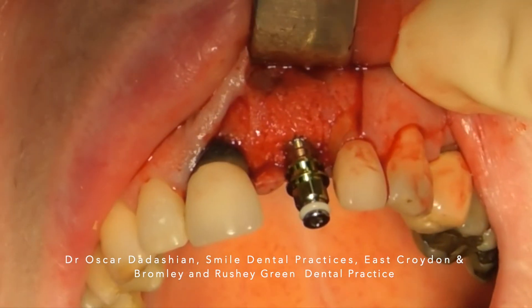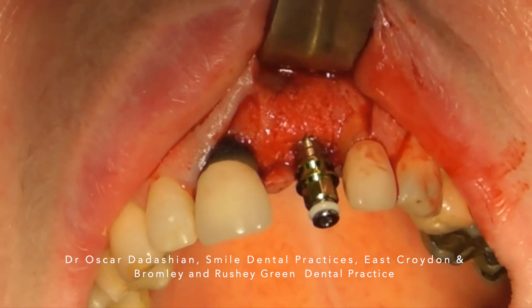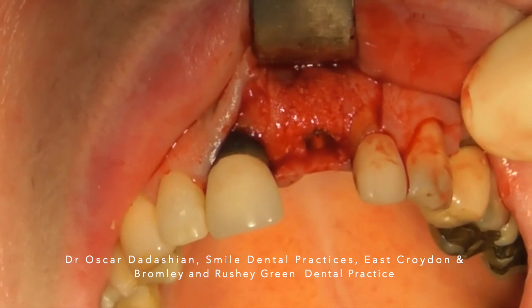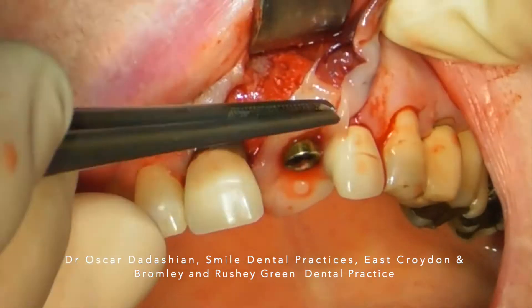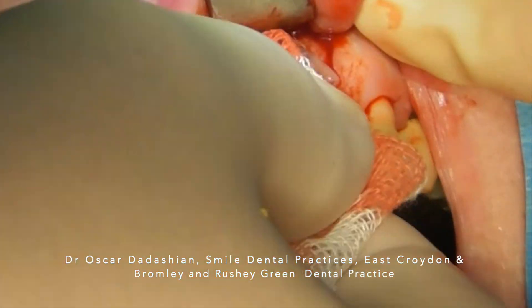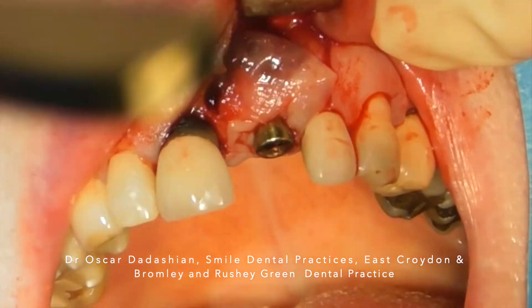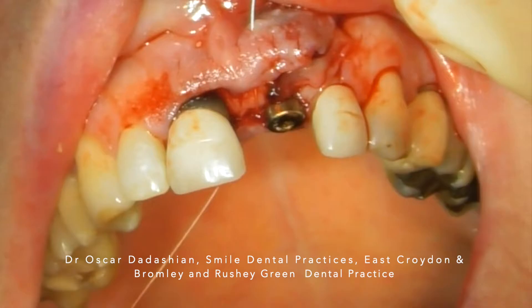The slow resorption property of xenograft is going to maintain the shape of the crest over a longer period of time. Here I'm placing my healing abutment and a PRF membrane — I'm tucking the PRF membrane over the site and suturing the soft tissue by displacing it more coronally.